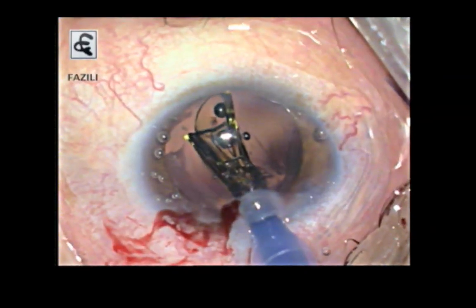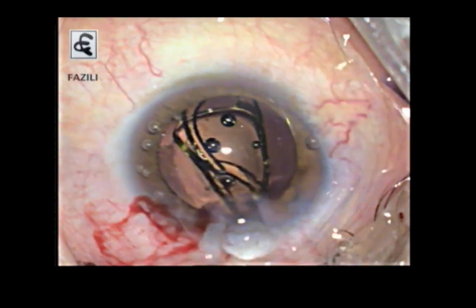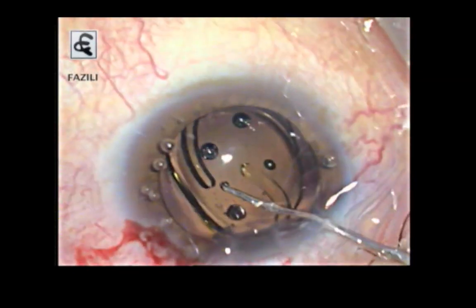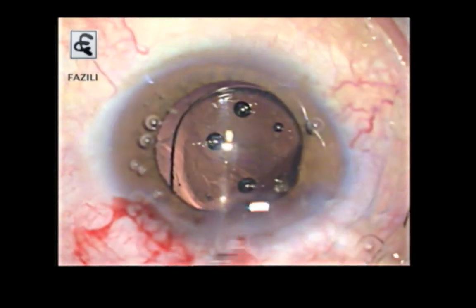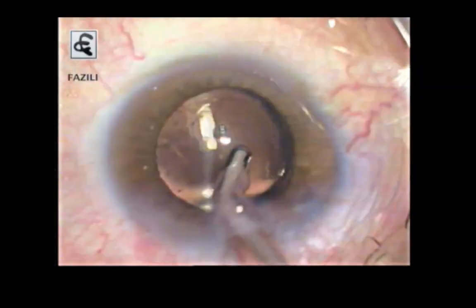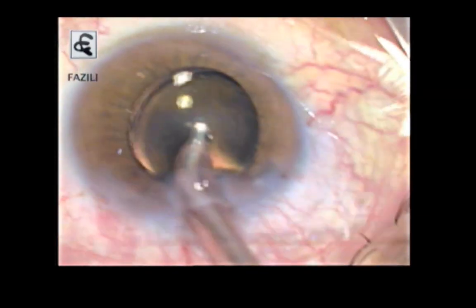In all these patients, you will see that there are 3 points where the chamber fluctuation can occur: when you're taking out the phaco tip after doing phacoemulsification, when you're finishing and doing an IA and taking out the IA probe, and at the end when you are removing the viscoelastic.